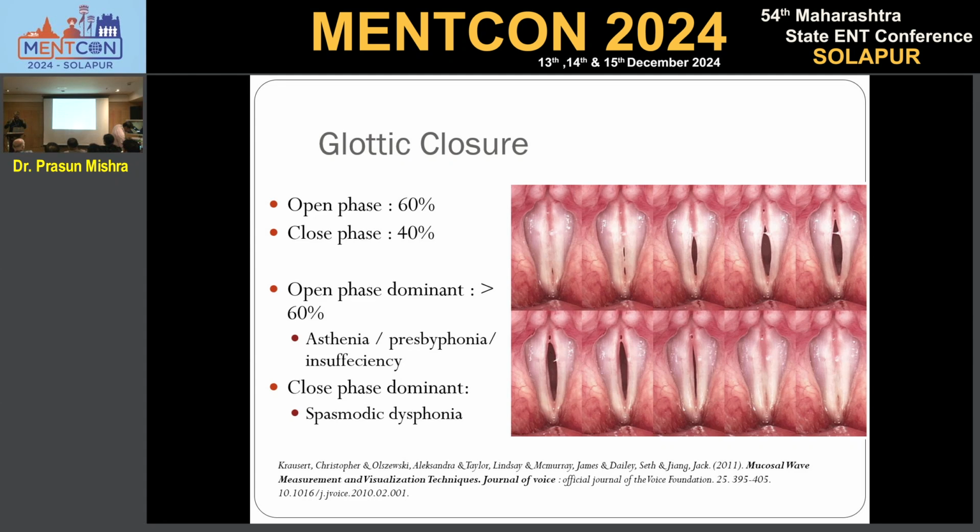Again, seeing such a large scope being put in somebody's mouth, first of all any of us will have apprehensions. Okay, I am coming to this point. Theory we can read, but putting this scope, doing this scopy, a lot of time the patient has a lot of gag. So how to prevent this gag? Lidocaine spray is one way. We do use that, but does that relieve the gag always? No. A lot of time patients have this gag reflex.